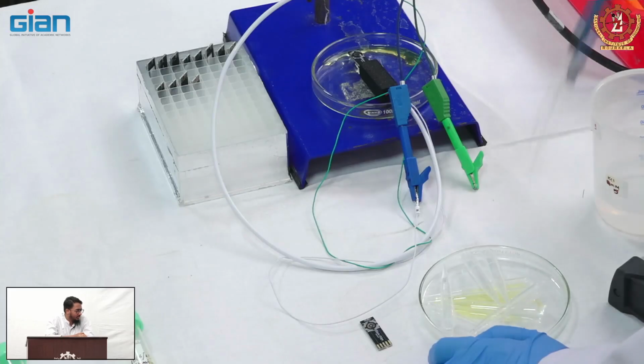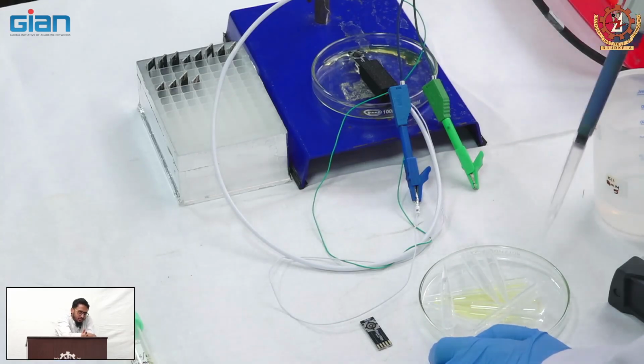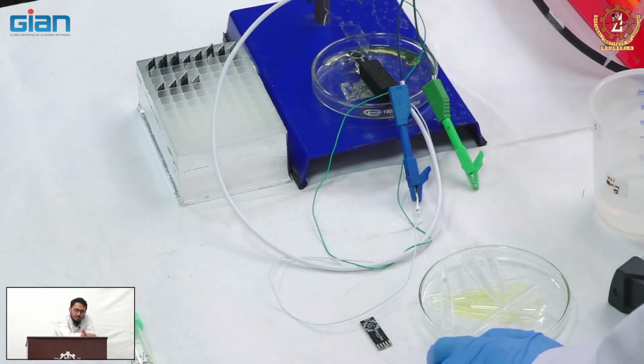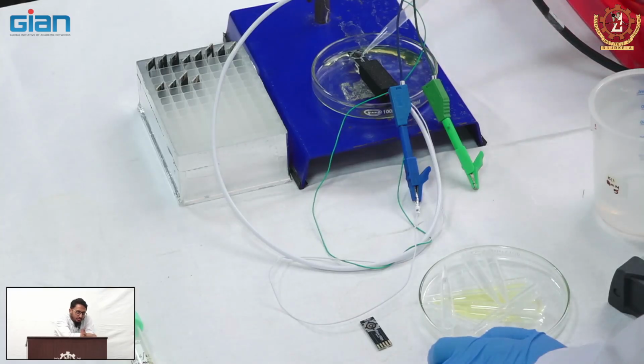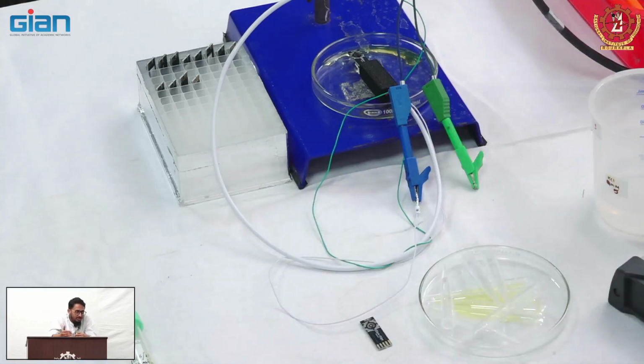So now we are covering it with 5 millimolars, right? You can actually choose the millimolar concentration based on whatever you like. There is no requirement that you have to go for the same millimolars. You can do in orders of 10 as well, depending upon the range you are trying to detect.